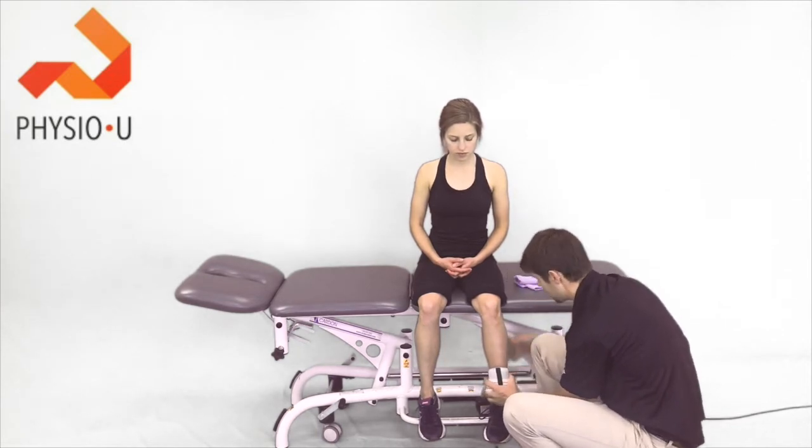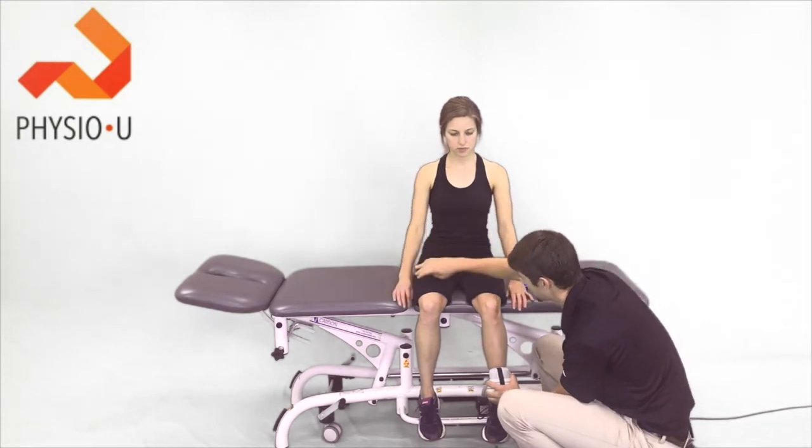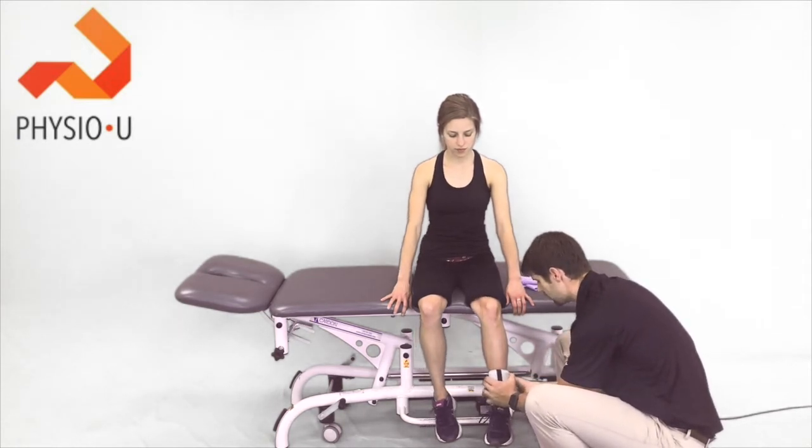With the patient seated, we use some type of belt to fixate the handheld dynamometer and her knee is flexed to 85 degrees. Have the patient hold on and stabilize her trunk, then I'm going to help stabilize the machine while she goes and kicks out. Alright, go ahead and kick out as hard as you can.